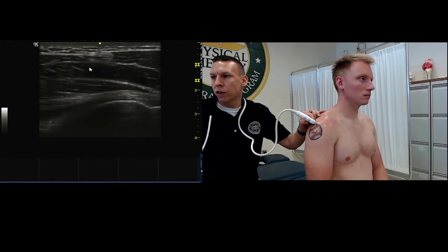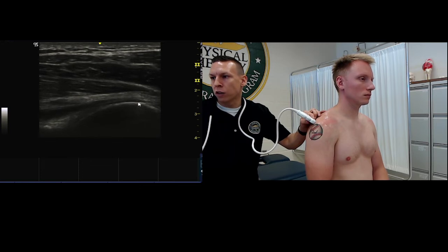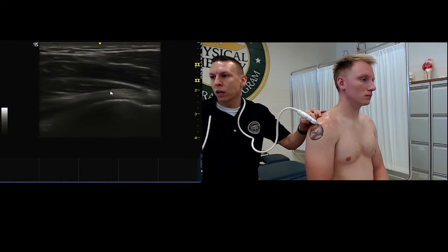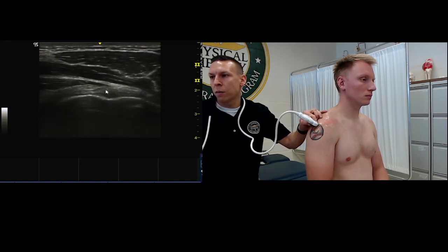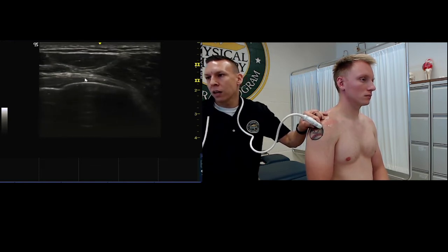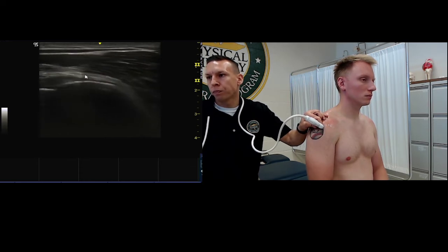You should be able to see this very bright aponeurosis of the infraspinatus right over top of the humerus, and that's this structure right here. This right here and this right here are muscle fibers of the infraspinatus coming and attaching into the aponeurosis to become the tendon here. And then we want to find this tendon and observe it attach all the way to the bone.